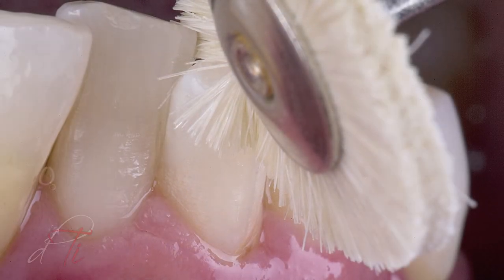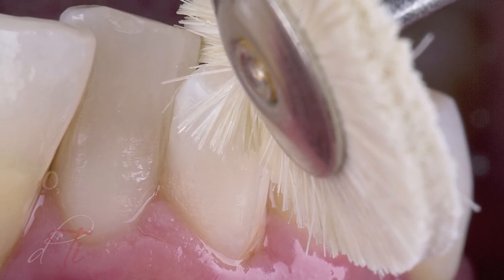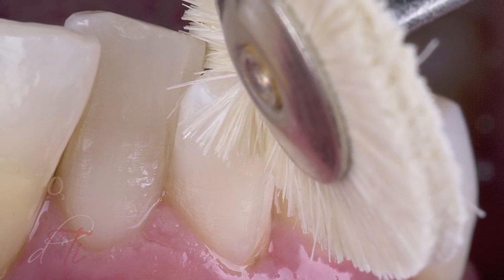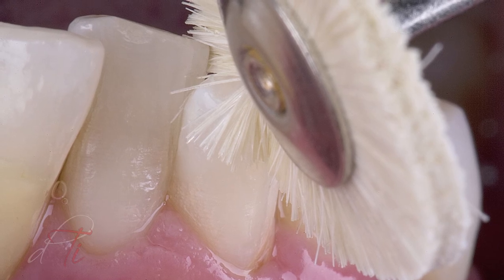After the dental dam was removed, a definitive luster and surface reflectivity was accomplished with a goat-haired wheel and diamond polishing paste using an intermittent staccato motion.